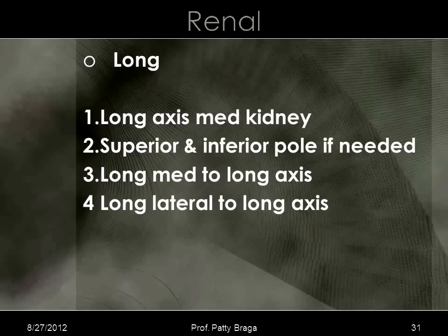So you don't necessarily take a picture of every single part of the kidney, but you have to make sure that you scan through it.